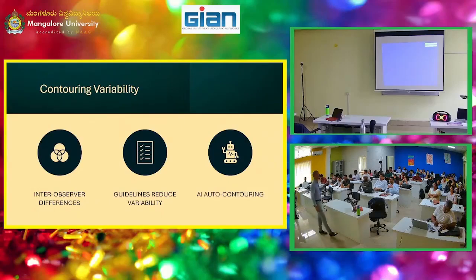So let's talk about problems that you as engineers need to be aware of and guide, but it's not your problem. What it is, who are you asking to contour? Okay? So if, let's say you didn't exist as engineers, how would we do it? Well, we would show these scans to experts, typically radiologists, or I'm drawing a blank here. There's a section in radiation therapy that's for radiology.